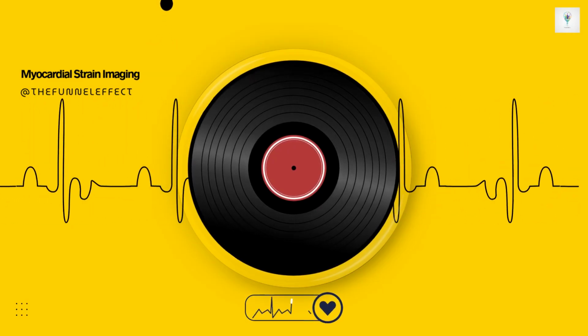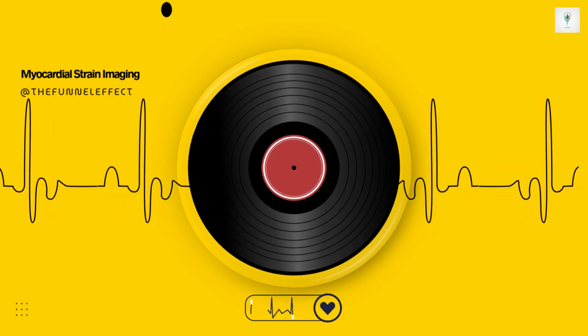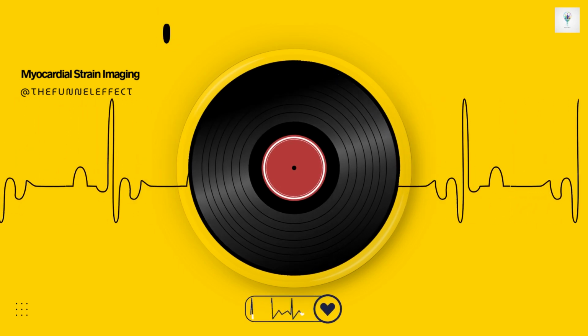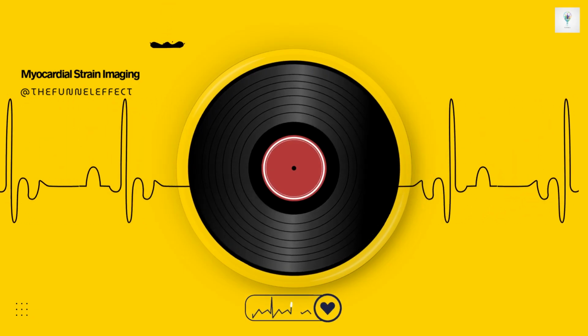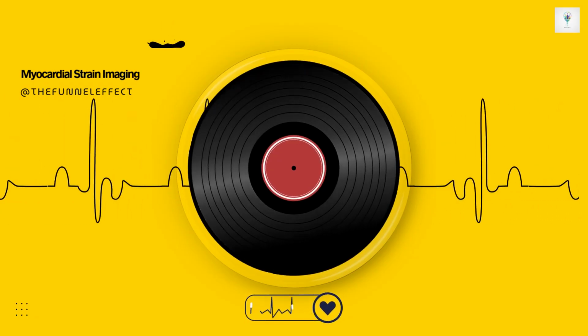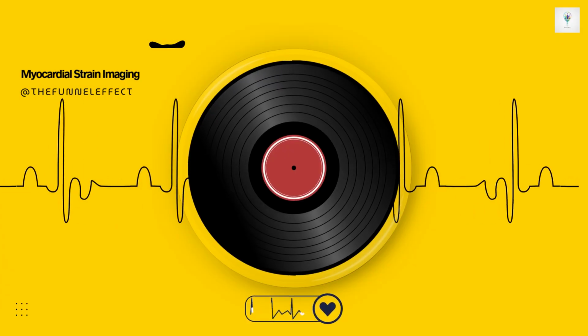Yes, it can often be detected in asymptomatic individuals who carry the gene for ARVC long before standard RV function parameters like TAPSE or FAC become abnormal. Both abnormal RV free wall strain and prolonged RV mechanical dispersion have been associated with future arrhythmic events in ARVC patients, making strain vital for risk stratification and guiding management like ICD placement.